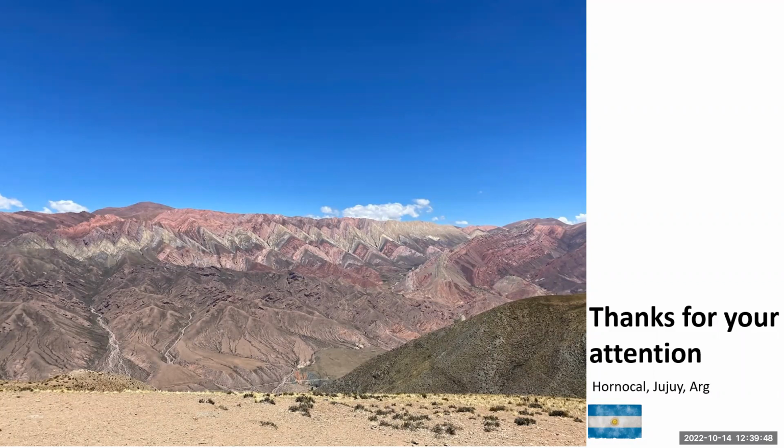And I think one last question. Is there any role of parametric mapping in these cases? Yeah, it's a really good question. There are very few studies. The thing is that this is a regional disease, mostly like sarcoid, multifocal, so it is maybe tricky to use mapping as a tool for identifying, for example, diffuse fibrosis.